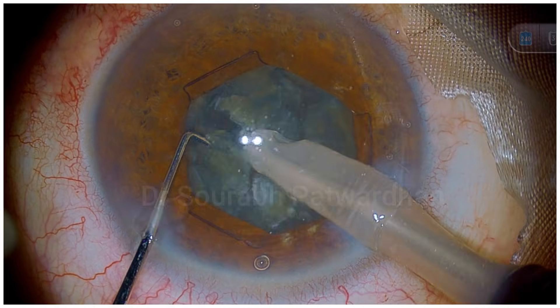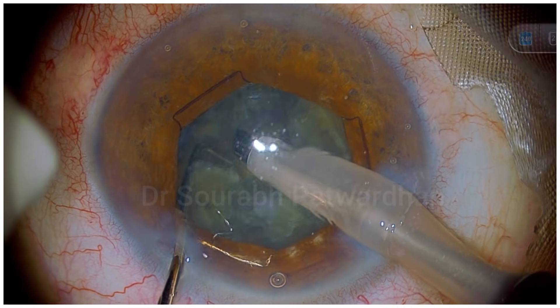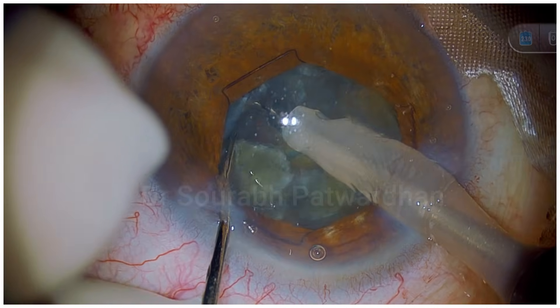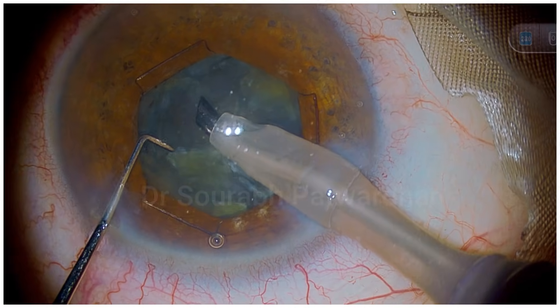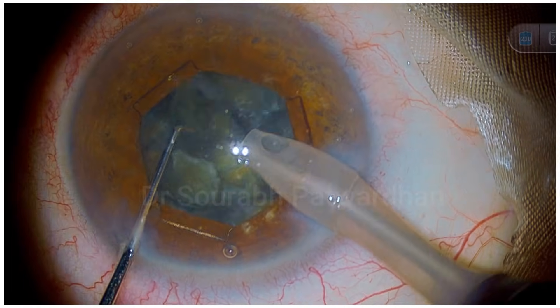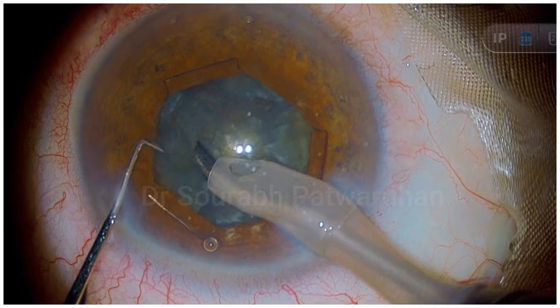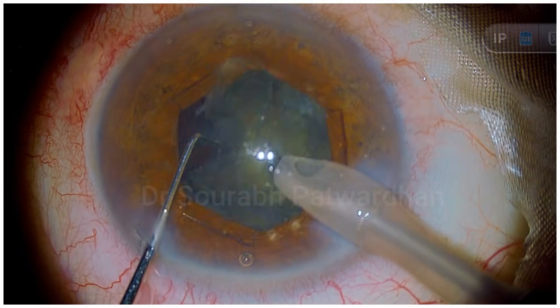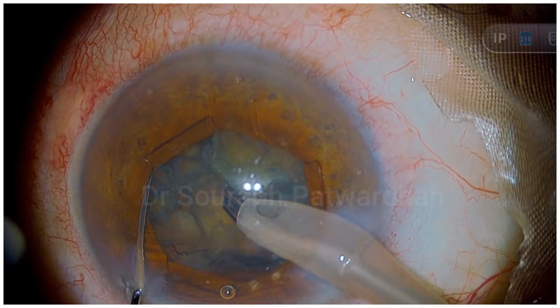Make sure you have adequate depth of the trench — that is something to focus on — and make sure you have complete divisions. In soft, mushy, or gluey cataracts it's difficult; many times once you feel you have achieved division I still continue a little bit of deeper trenching so I have a clear division. Once I feel at least one piece is separated from the rest I can then pull out. I am using quadrant removal mode with high vacuum on linear mode to pull out these soft pieces.